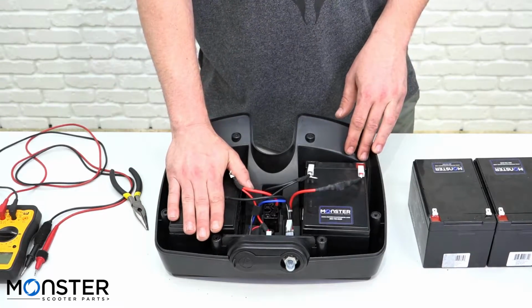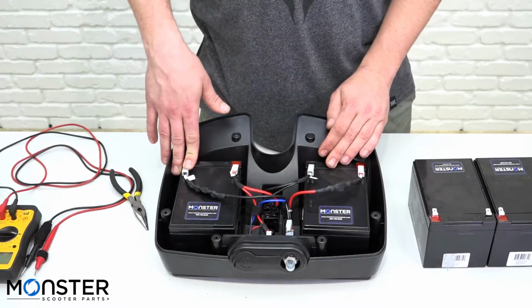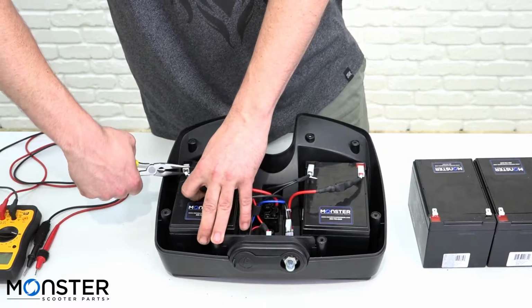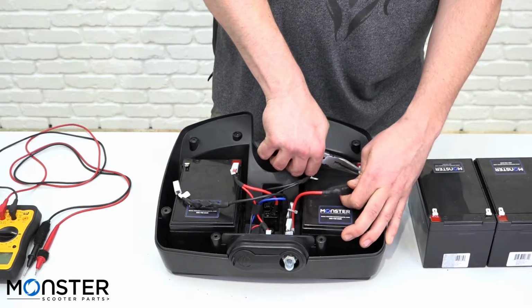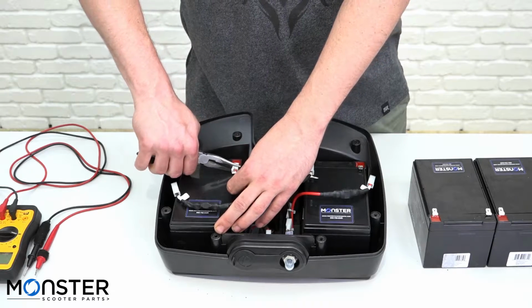I'll be referencing this as my right side. This will be my left side. We'll start with our black outside negative wire. As you can see, these pliers do come in handy. Then we'll do the left side positive outside wire. Then the inside positive right-hand side wire.